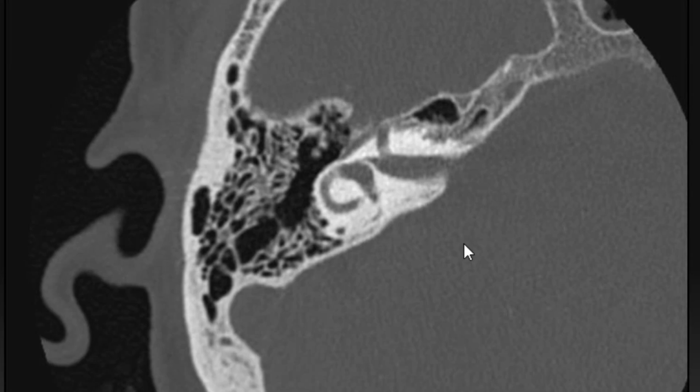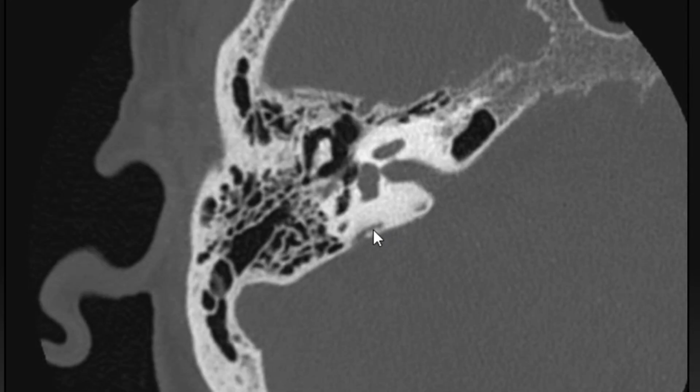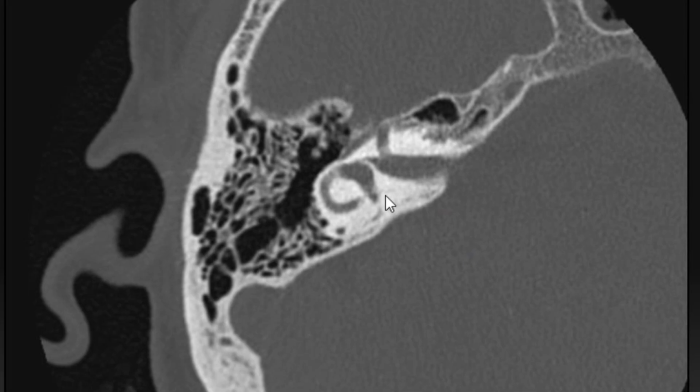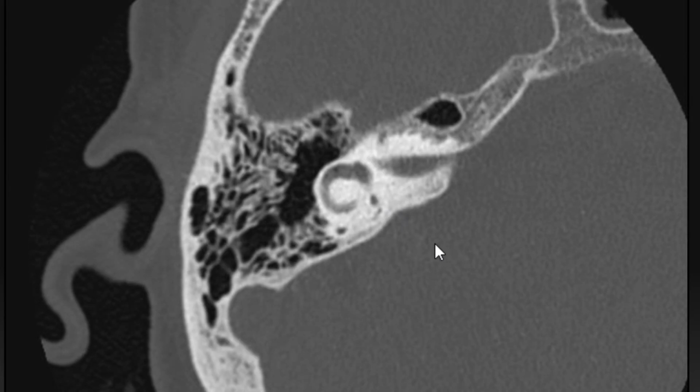So this is pretty good. It's not completely perfect, but it's pretty good. So we see that. And that's the first step. We want to be looking at the correct axials. Now we look at the vestibular aqueduct first. It's really hard to see the isthmus portion. It's almost invisible. But we always know, based on histopathology and on slides we looked at, the isthmus almost invariably exits the vestibule at 14 degrees. And it's 14.3 degrees, but for all practical purposes, 14 degrees. So now we don't even try to look for the isthmus because it's really hard. Maybe on a photon counting once in a while.